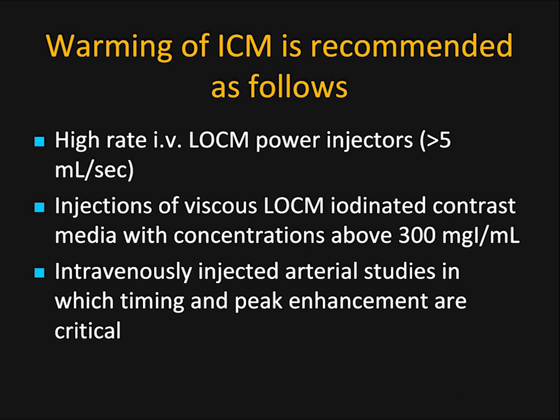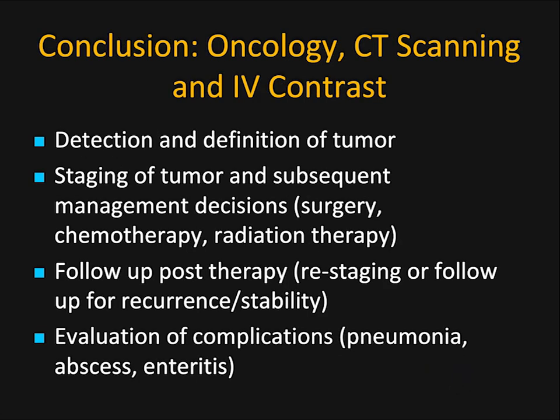I also recommend warming the contrast. There have been several articles showing that when you warm the contrast, many of the side effects, even the mild feeling warm or taste, disappear. But also when you warm contrast, there's less issues with extravasation. There was an article from Duke that said you had 3 times more extravasations, same population, if you did not warm the contrast. Warm the contrast. It's really easy. 37 degrees, get a warmer.